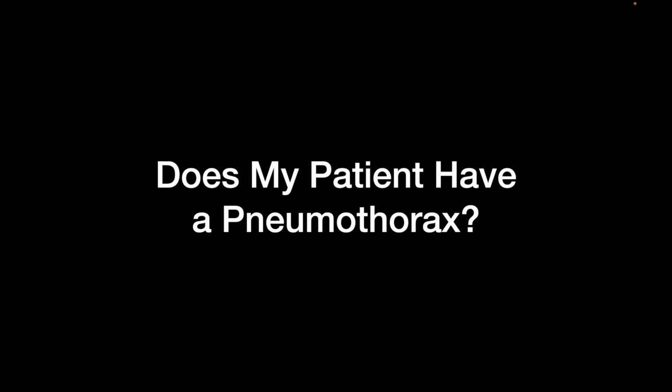There are some specific questions that we need to ask when we are doing a focused examination. This comprehensive examination was for my daily rounds in critically ill, probably ventilator patients or patients having any lung pathology, where I want to check the progression. In this, I have a specific question in mind. The patient has come into the ICU, or has developed a new onset problem, or has just entered the emergency. One of the most common questions that we ask is whether my patient has a pneumothorax.